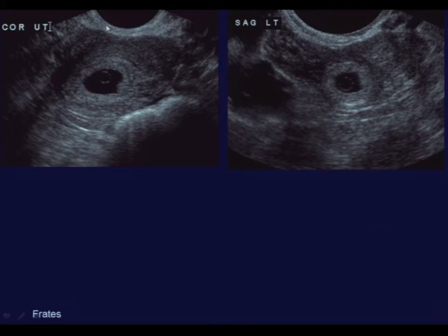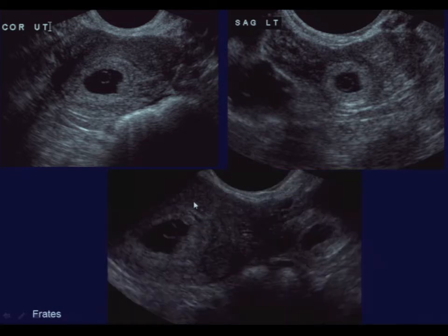Here's a patient. This is the coronal image of the uterus, and this patient has an intrauterine gestational sac. You can see the echogenic ring. You can see the yolk sac in the center. However, in the left adnexa is an almost identical appearance of the ectopic pregnancy with the trophoblastic bright ring and the central gestational sac. So this patient indeed has a heterotopic pregnancy with the intrauterine pregnancy here in the uterus and the extrauterine ectopic seen in the left adnexa here. But these are incredibly similar appearances of the intra and extrauterine pregnancies.